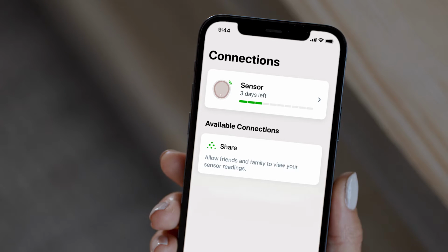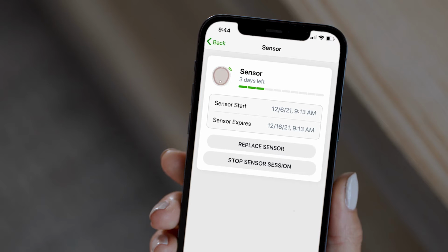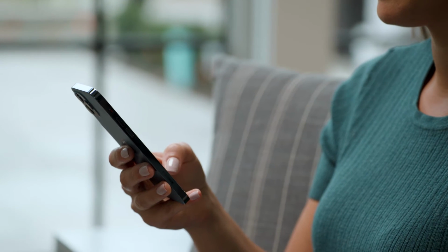To end the session early, go to Connections and tap Sensor. You can either replace sensor if you want to start a new sensor immediately, or stop sensor session if you want to stop this sensor without starting a new one. The other option is to wait until your sensor automatically ends. At this point, the app will tell you it is time to start a new sensor.